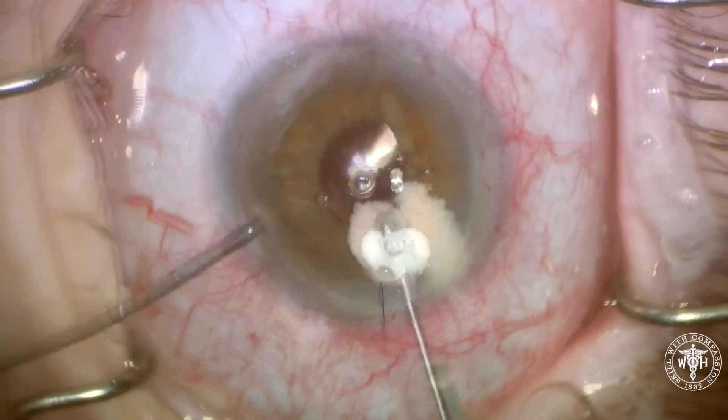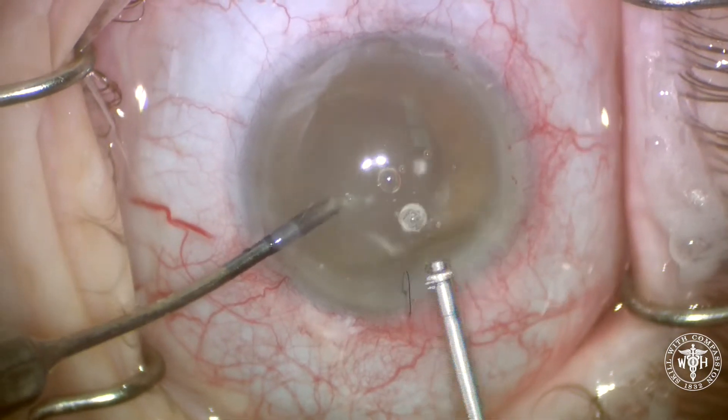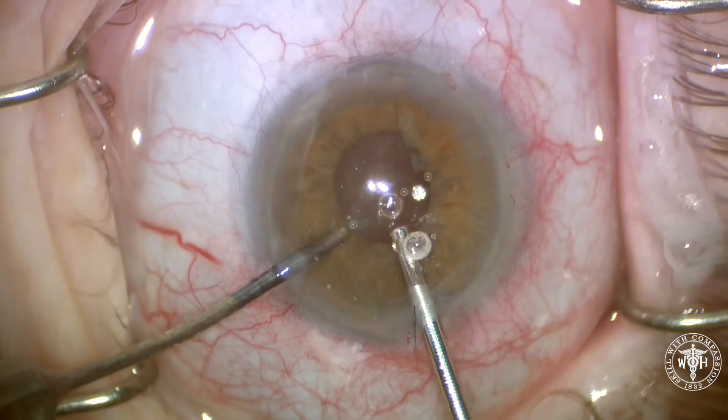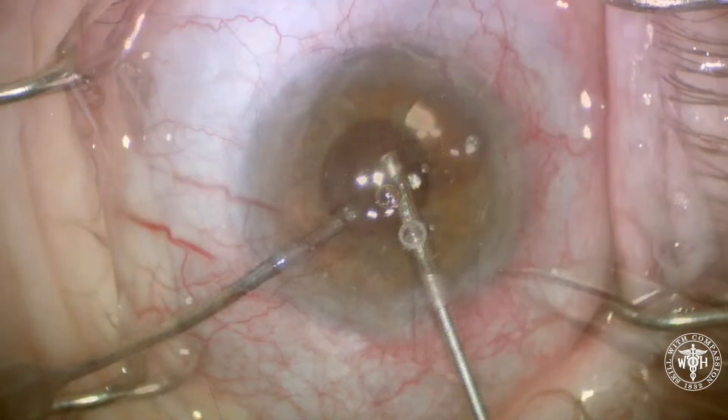The case ends with a small anterior vitrectomy using Kenalog or Triessence, just to make sure no vitreous is prolapsed through the wound. One or two sutures are placed to keep everything watertight.